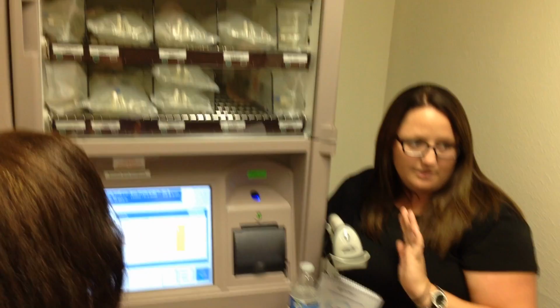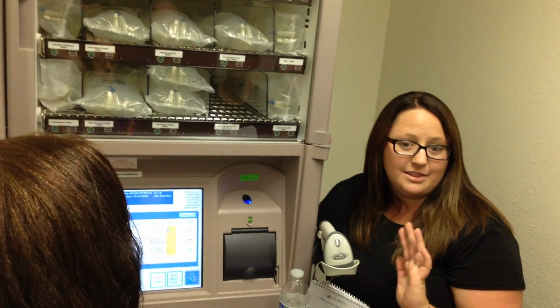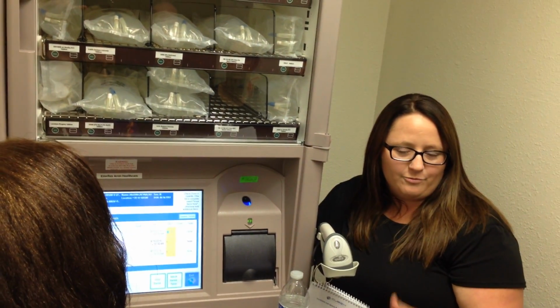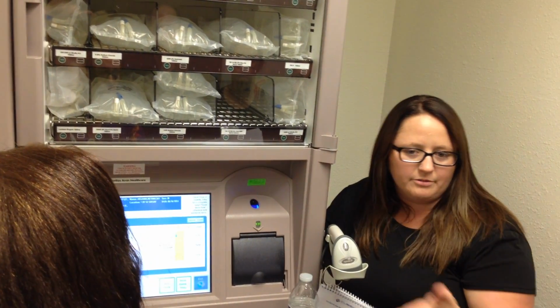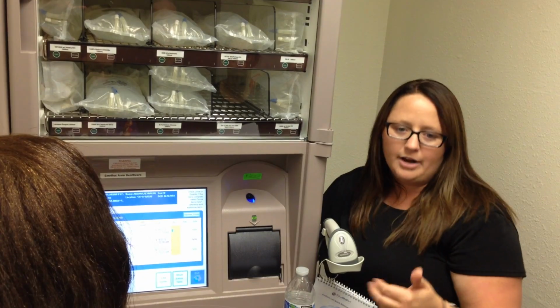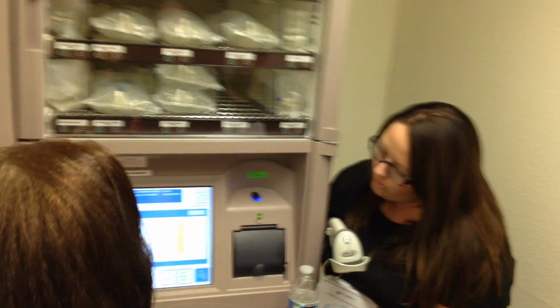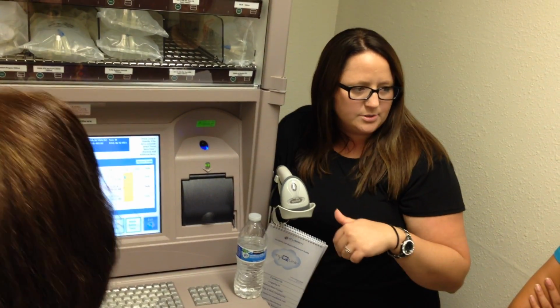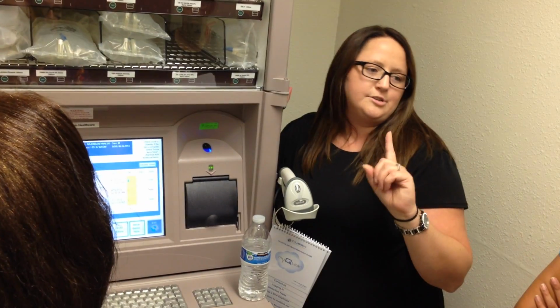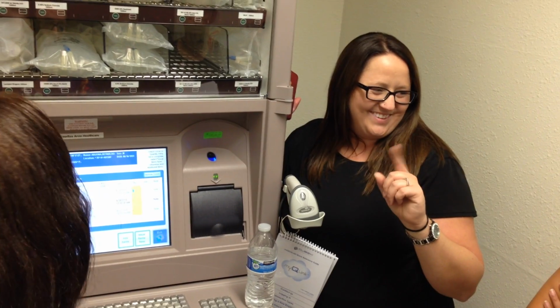You would know because you should have already asked the patient what they need, right? So the patient is indicating how many they want. They're on a scale of range from 1 to 2. They're telling you how many they need based off of whatever scale you use, right? Yes, the pain scale. So you would be typing this in here. You just tap in the yellow box and change the quantity to what you need. For that dose, you're only pulling 1 dose at a time, okay?